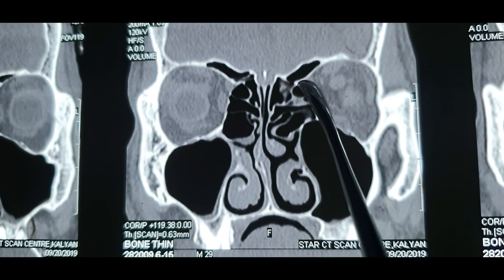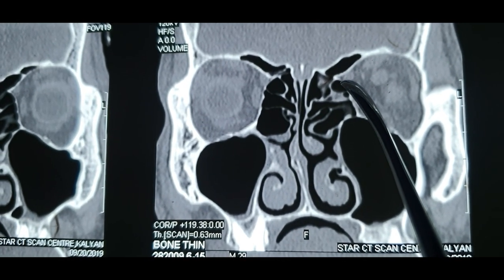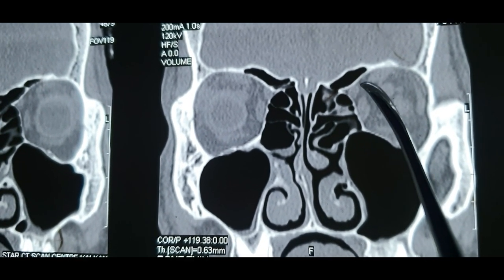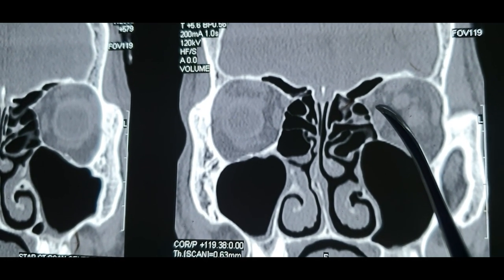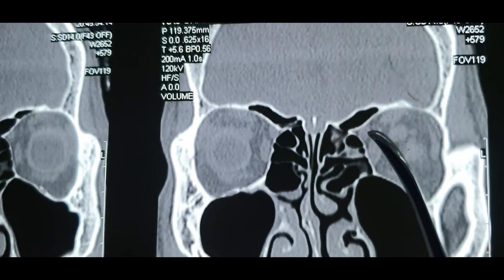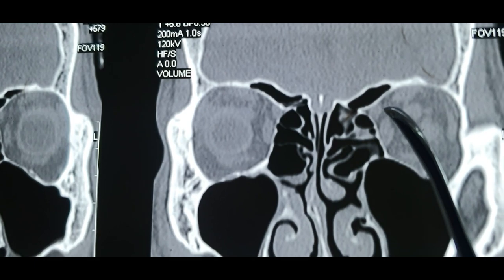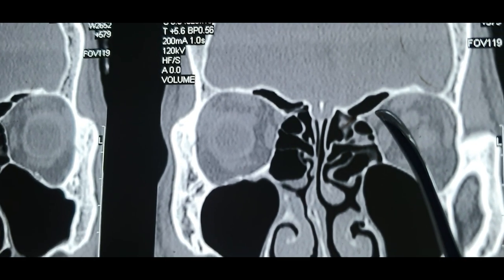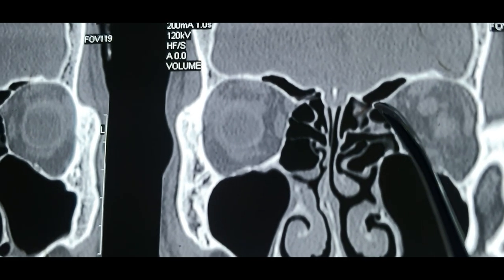Now, the course of the anterior ethmoidal artery. Now, as I said, the anterior ethmoidal artery is a branch of the ophthalmic artery, which in turn is a branch of the internal carotid artery. Once in the orbit, when it is given off by the ophthalmic artery near the medial margin, a bit towards the posterior aspect and the medial margin of the orbit, it runs in an intraorbital canal along with the nasociliary nerve. Now remember, it is along with the nasociliary nerve in the orbital part. The moment it comes near the medial rectus and the superior oblique, it forms a nipple, the Kennedy nipple sign.